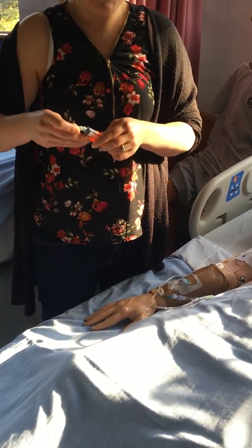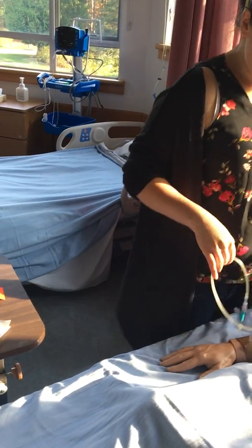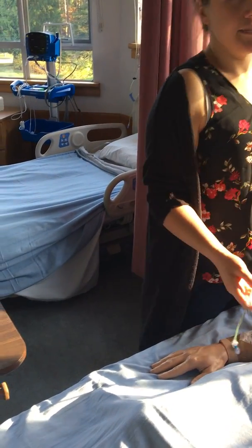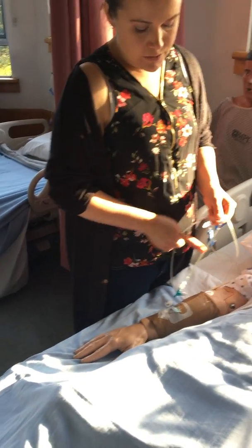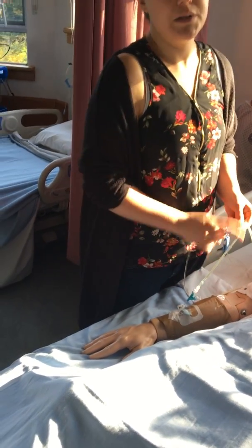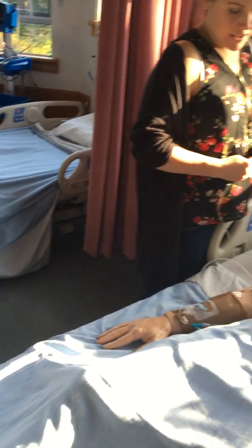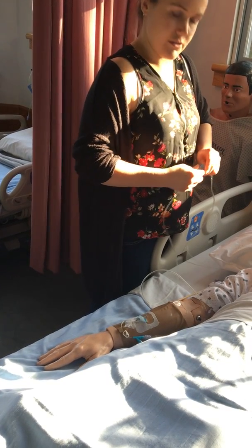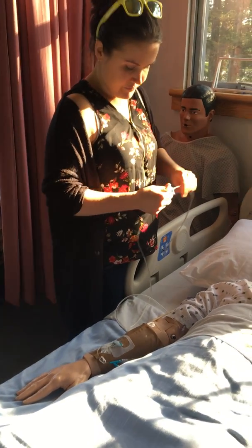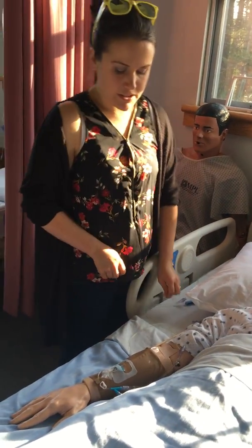So we had a little bit of a debate about whether to flush this at the same rate and decided not to, because the rate her IV is set at is 100 milliliters per hour, and 2.5 mLs in 30 seconds is 300 milliliters per hour. So by restarting her IV, I'm sending that medication in at a slower rate than it's actually ordered on the IV monograph, so it is safe. Okay, so I've restarted her IV, make sure it's going at 100 milliliters an hour.